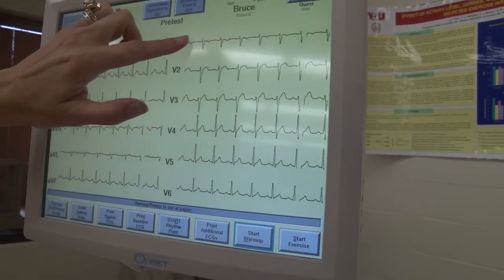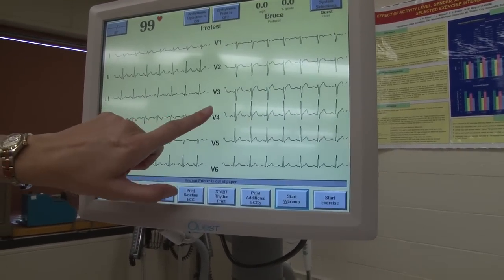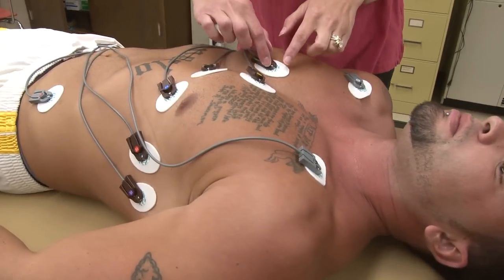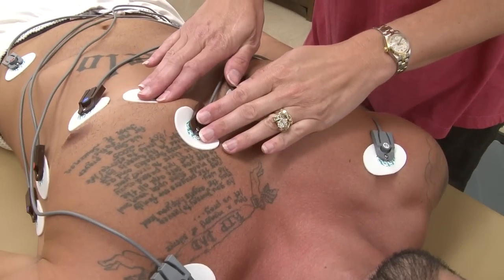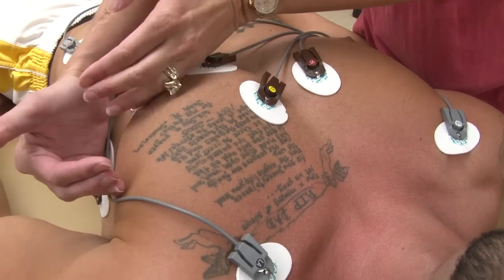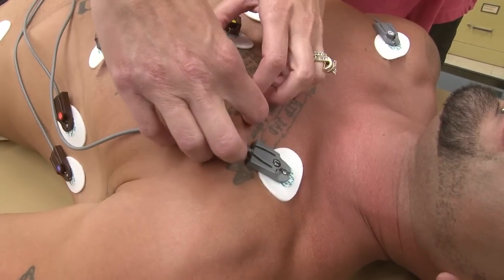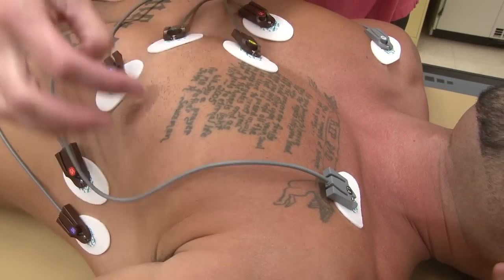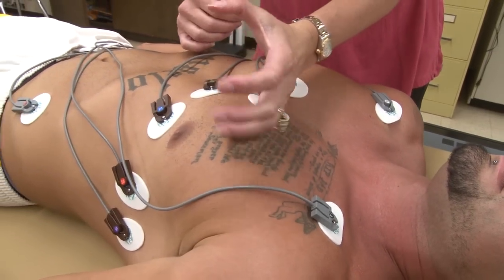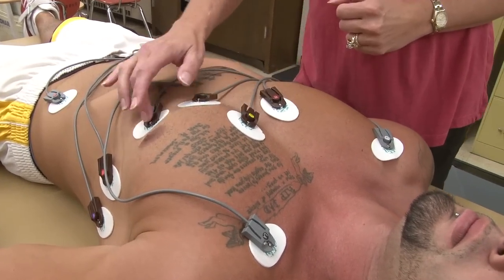So let's take a look at why V1, V2, and V3 are mostly below the baseline, and V4, V5, and V6 are mostly above. Coming back to our client, we'll see that V1, V2, and V3 sit up here close to the top of where the heart is. V4, V5, V6 sit down towards the bottom of the heart. Now if we were to open Jake up, we would see that his atria are sitting about here and his ventricles are sitting about here. So what happens with contraction is a positive wave, a positive wave going down through the heart. These are positive electrodes.